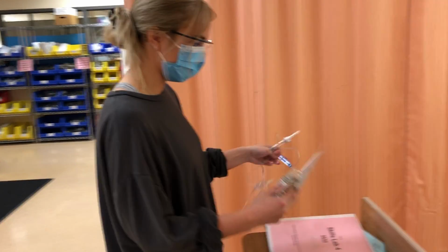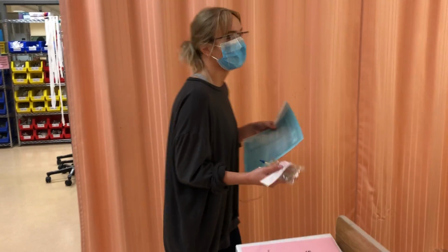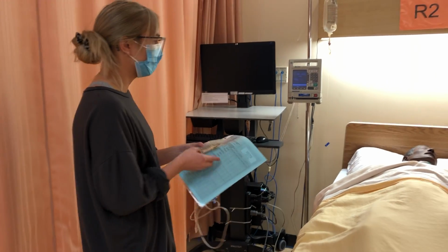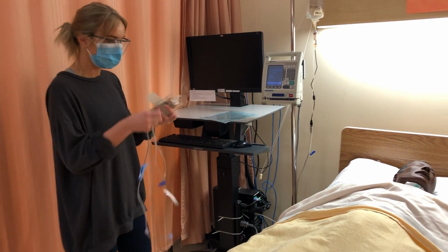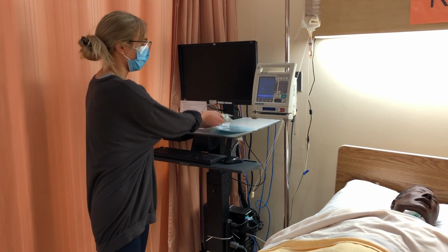Okay, so I'm going into the patient's room. I'm just introducing myself. Hi, my name's Paige. I'm your student nurse today. So I have your insulin infusion. It's been ordered to help manage your blood glucose levels. So it's been ordered so we can get you into that goal blood glucose range of 6 to 10.